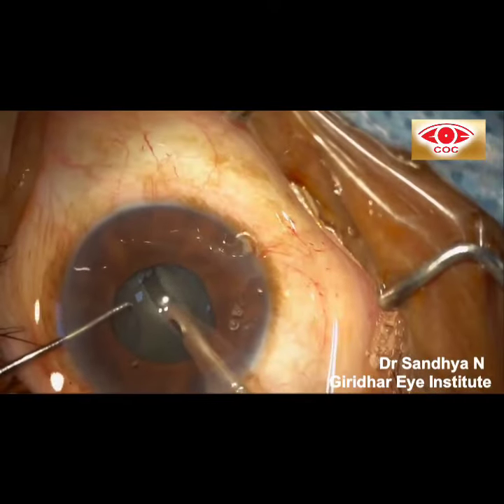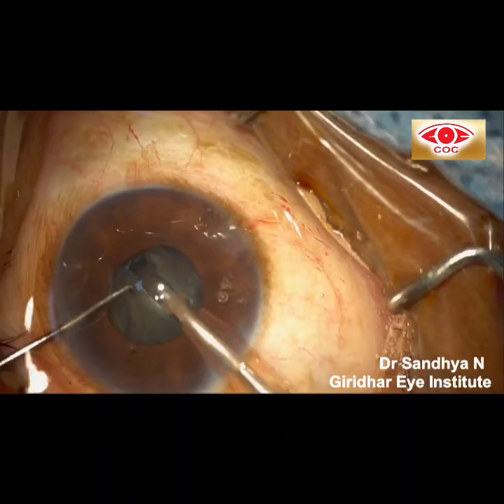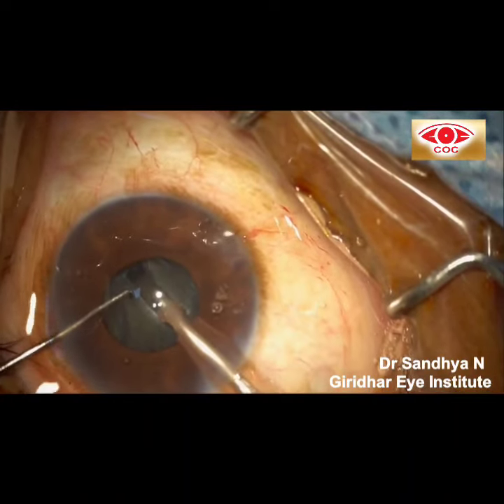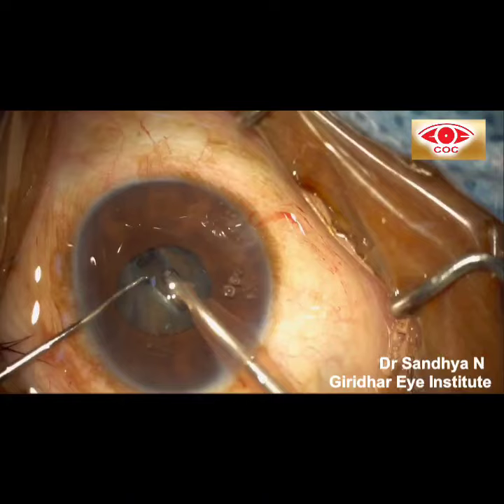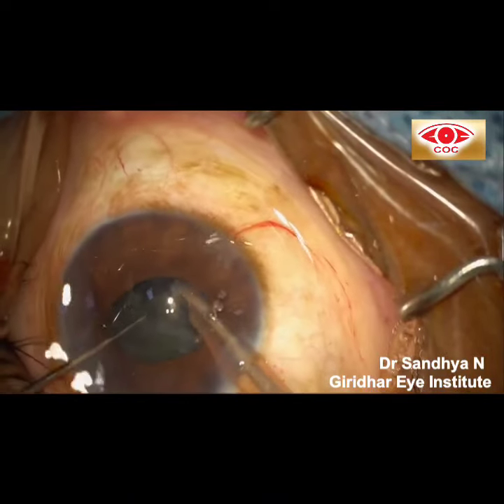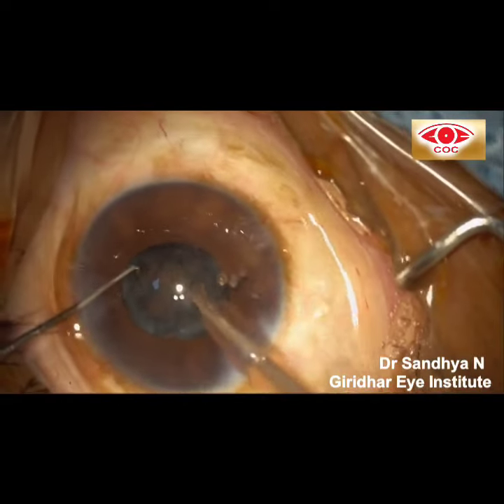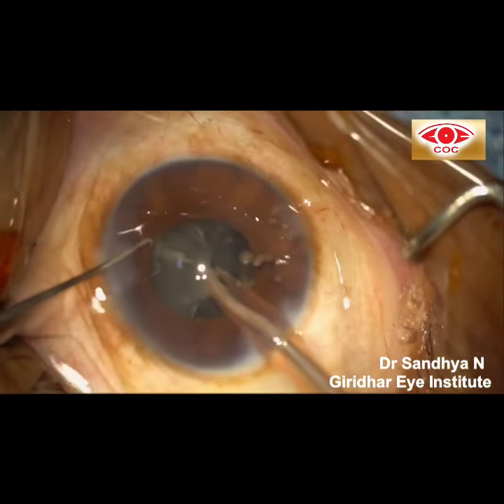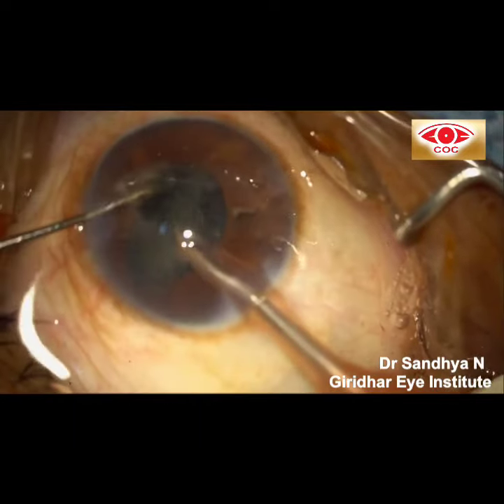Here there was fluttering of iris, progressive miosis and tendency for iris to prolapse through the side port where the dialer was placed. Now I had reduced the phaco parameters. The anterior chamber became stable with less turbulence, iris fluttering and tendency for iris prolapse. Though it takes slightly longer to complete the surgery while lowering the phaco parameters, it is very helpful in maintaining the anterior chamber stability and reducing the manifestations of IFIS.